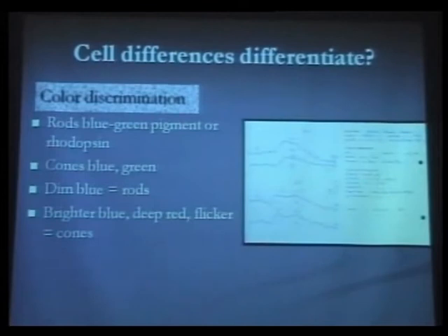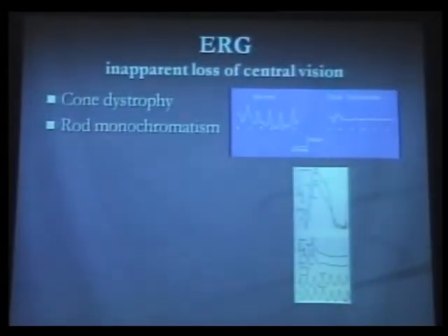What about color discrimination? Well, at the King Khaled Eye Specialist Hospital, we did color testing. We did scotopic blue and scotopic red. We did a dim blue to look at rod function, and a bright red to look at cone function. Cones, because they recover quickly, will show a biphasic curve, and rods give us a one-time only response. All right, so now we've regressed and looked at the basics.